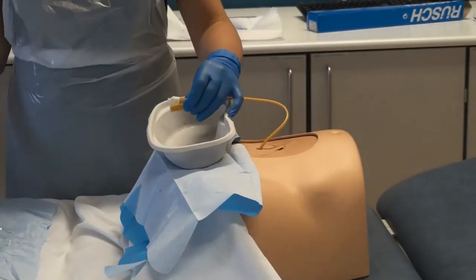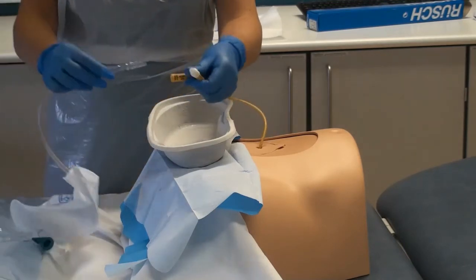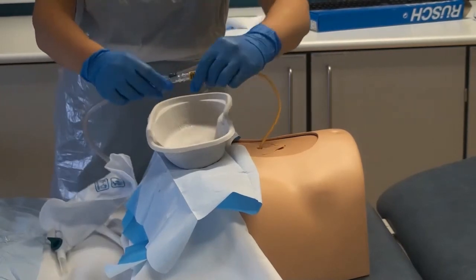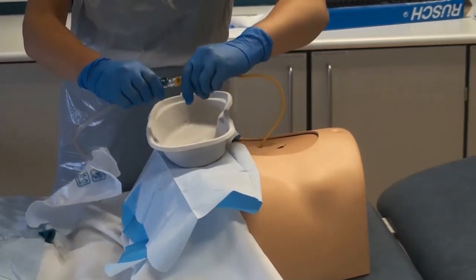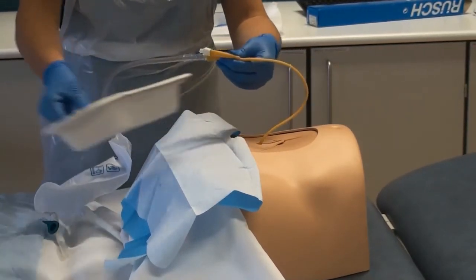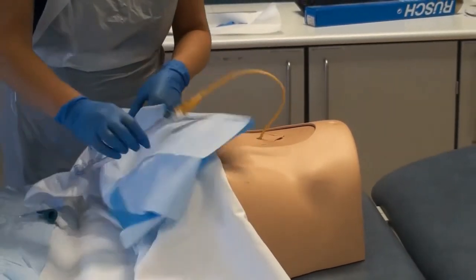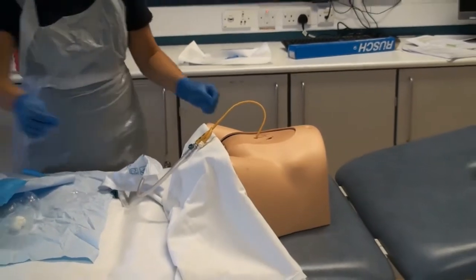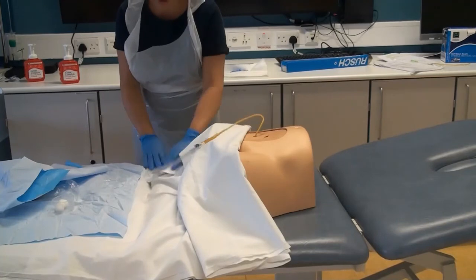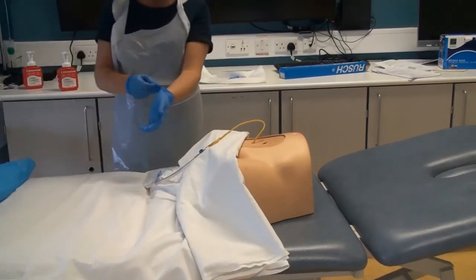Attach the catheter to the appropriate drainage system and secure it in a comfortable position for the patient. Dispose of equipment and materials safely and correctly. Maintain the patient's dignity and ensure that the patient is comfortable, dry, clean, and clothed.